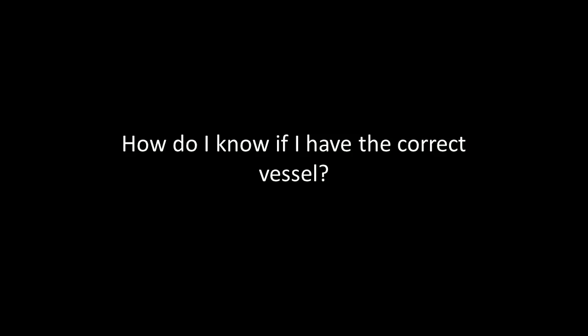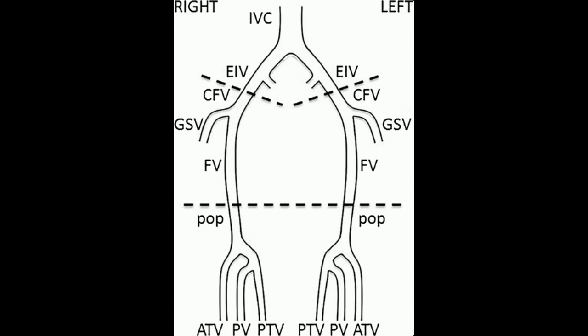Now I'll be showing the required images for this study along with some landmarks to help orientate yourself and to be able to differentiate the difference between veins and arteries. This image shows where the vessels lie in comparison to each other. We start off with the GSV, then go to the common femoral vein, then down to the deep femoral, and then femoral vein proximal, mid, and distal, all the way down to the popliteal. Then you get the PTV and the peroneal vein.